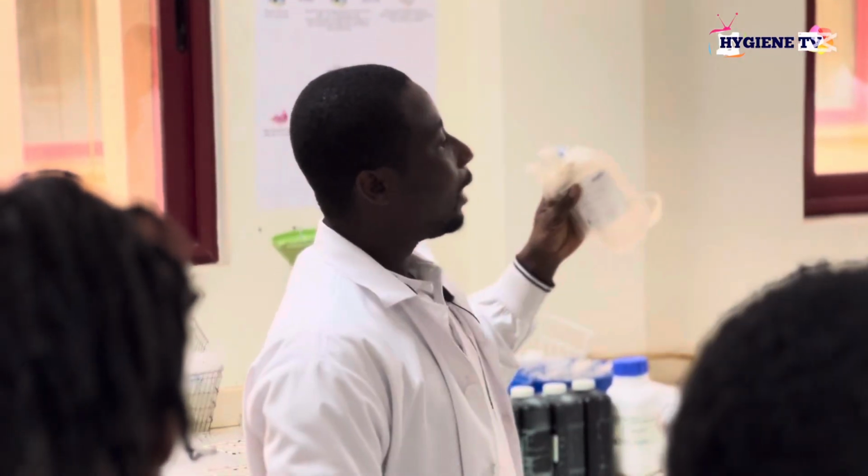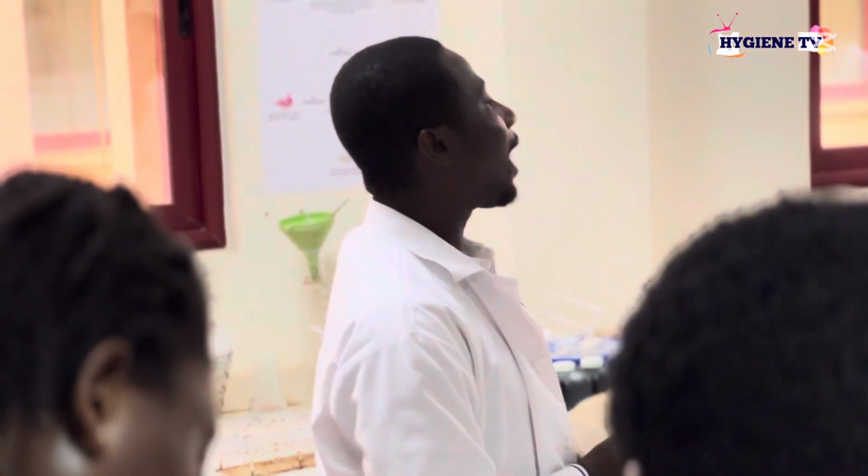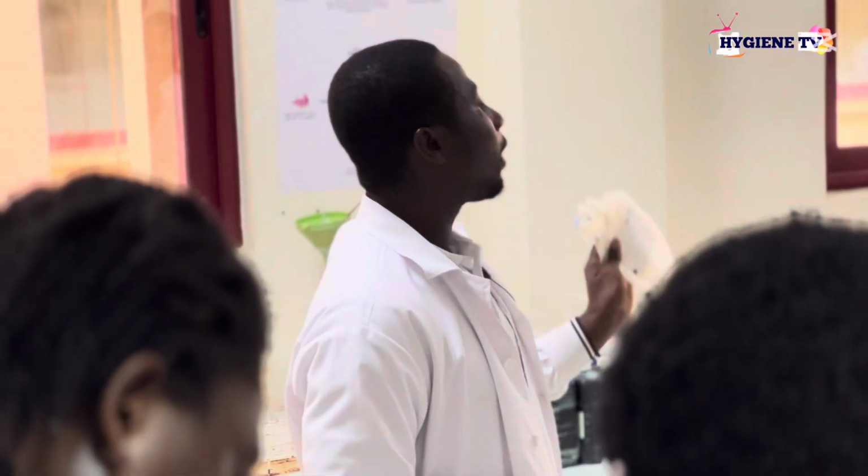This blood bag with the anticoagulant is able to keep the blood for as much as 35 days. After 35 days, the blood is useless and cannot be used again. On the 35th day at midnight, the expiry date has been reached.